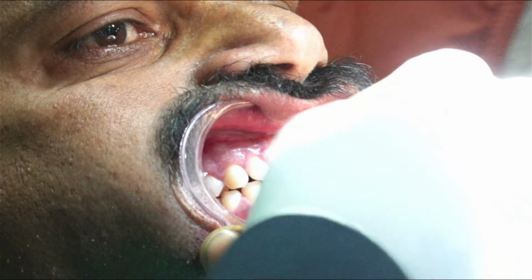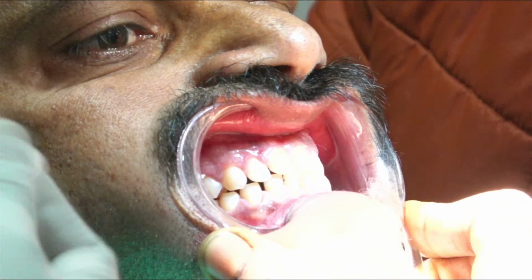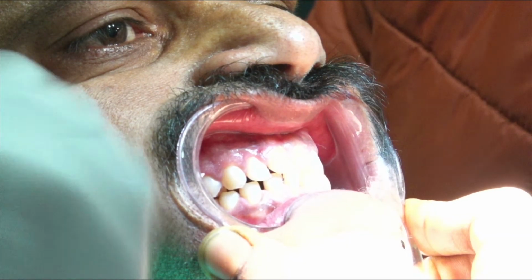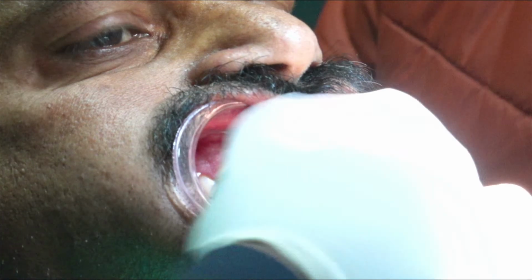First exposure, wait for 15 minutes, agitate like this and again wait for 15 minutes and then let him rinse, or take the cotton, first wipe everything and then he will rinse, right? So now suppose we have to, after 15 minutes, agitate it and again apply.